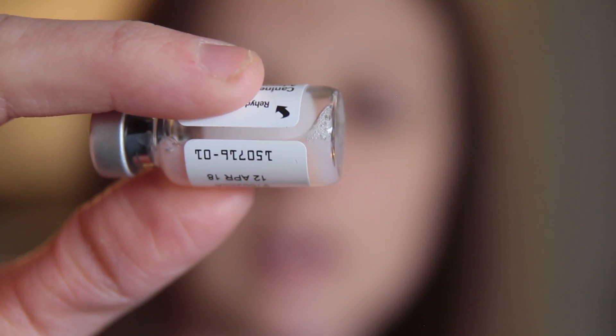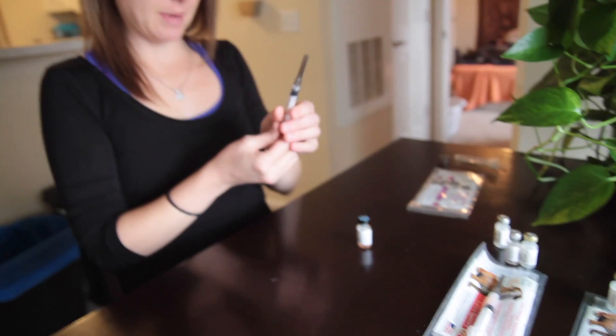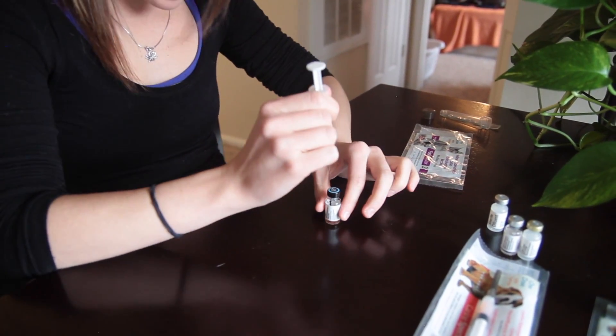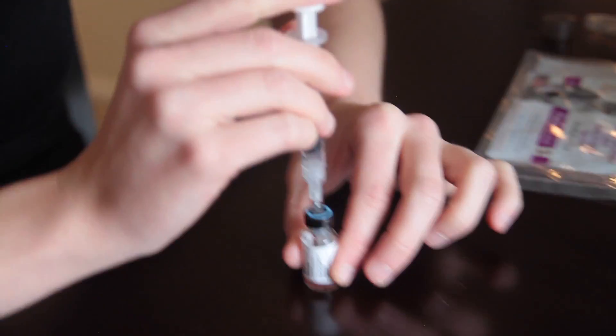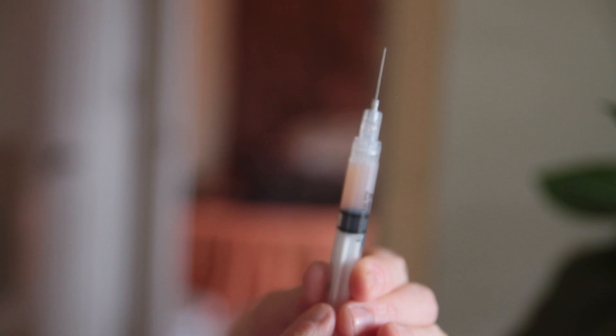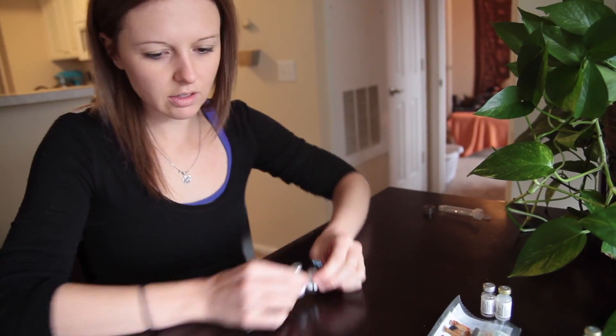So we're mixing, reconstituting. Do you want to do one, babe? You want to reconstitute one? Yeah, I'll try one. So can you see the little fluid in there? It looks pretty mixed — you'll notice there's just not any powder anymore. Back to my one mil of air. Hannah's our first victim. Guys, don't throw these glass vials in the trash when you're done — they're glass and we've got to dispose of them properly. Don't be a jerk. Here's all of our reconstituted vaccines. Let's do it!